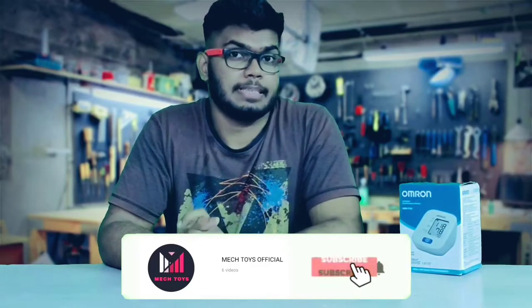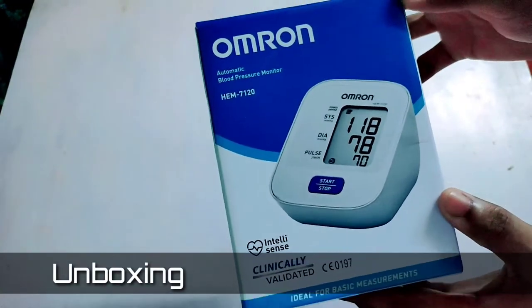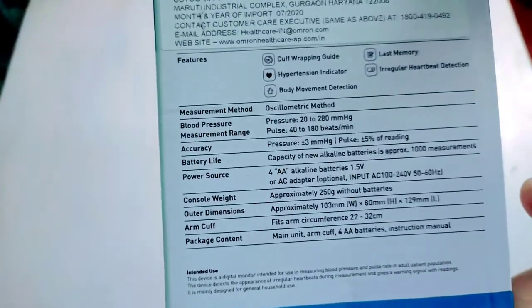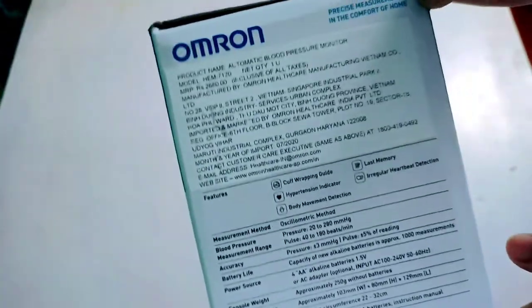Today we will unbox and review one of the best-seller blood pressure monitors on Amazon, the Omron HEM7120. Let's unbox it. It comes in a cardboard box with Omron's branding over it and all the tech specs and features mentioned at the back. We will discuss each one of them later in this video.